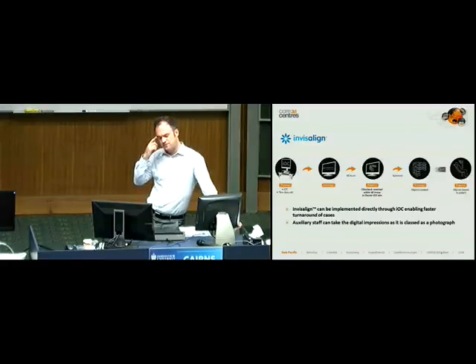Invisalign angle. Just interestingly, right now, I'm not sure whether it's the same in every state, but the technology is a little bit of a grey area in terms of what it is. It's not really an impression. It's classed as a photograph, which means that auxiliary staff can take the photographs, which is interesting and obviously very popular among orthodontists.